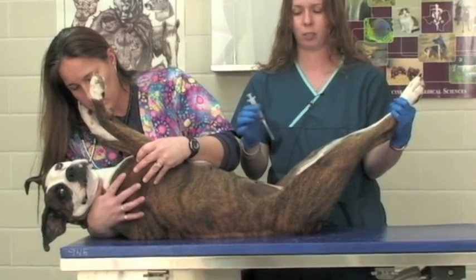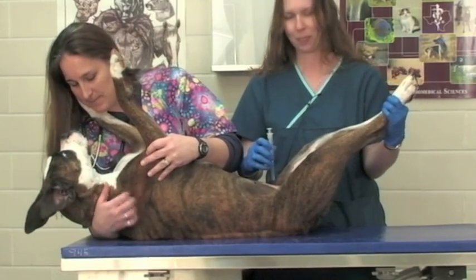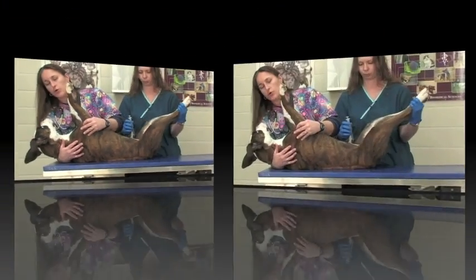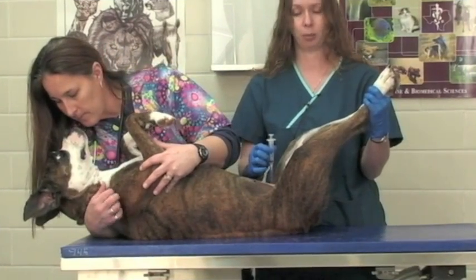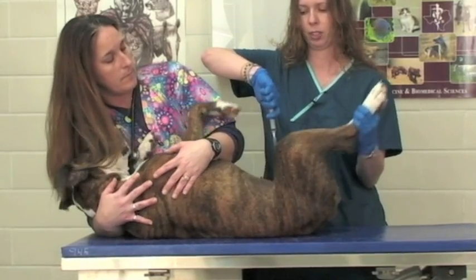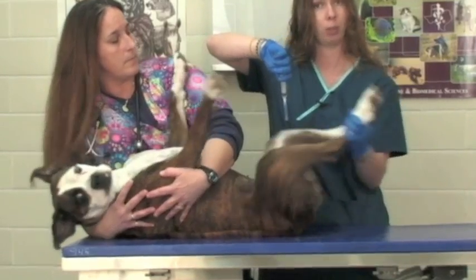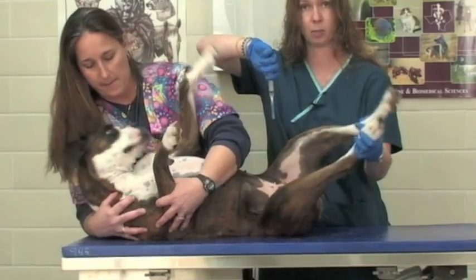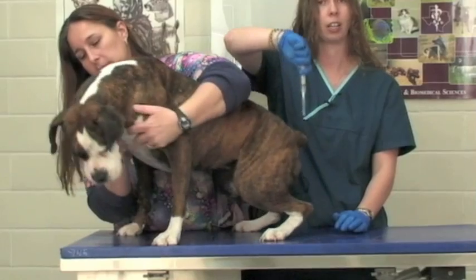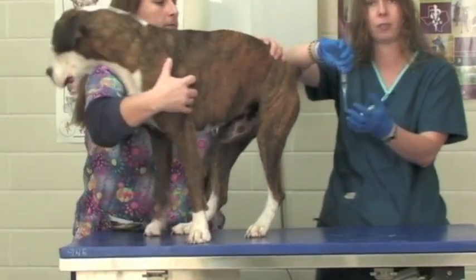If you angle any direction at all, angle caudally toward the patient's backside. You're less likely to hit any important structures if you angle towards the patient's back. So once you place your needle all the way — you bury your needle all the way into the patient's abdomen — you would gently aspirate. Hopefully you've obtained urine. If you have not obtained urine at that point, you can pull your needle and syringe further up just a little bit at a time and aspirate on the plunger very gently as you ease the needle out of the patient's abdomen. Hopefully at some point you will hit the bladder and get a urine sample.